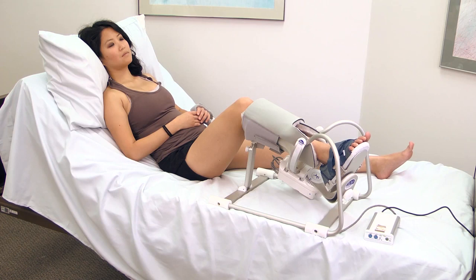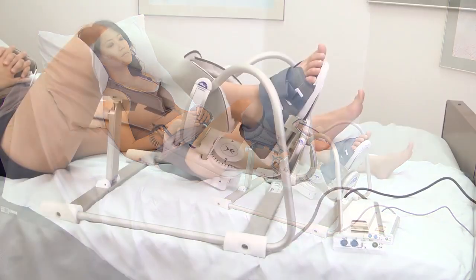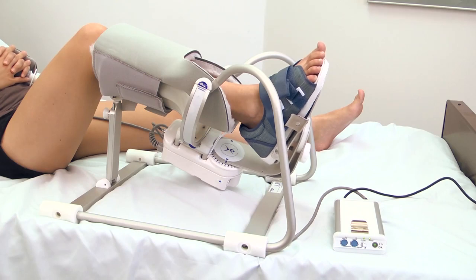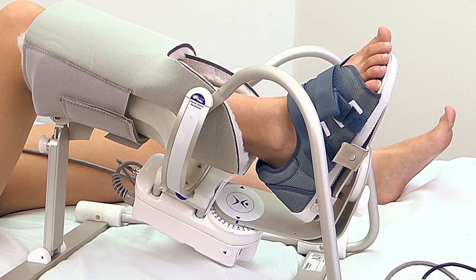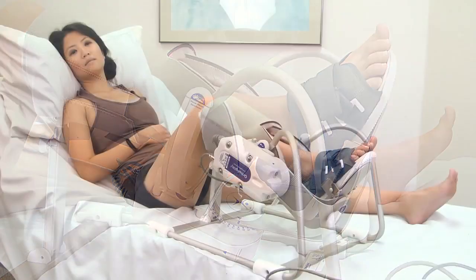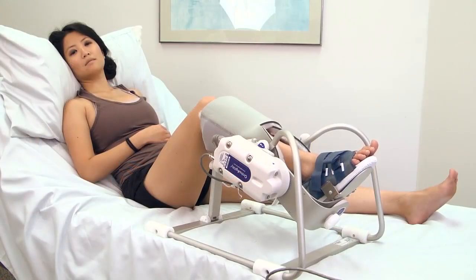For combined plantar dorsiflexion and inversion eversion, position the actuator and footplate at various positions to achieve the desired combination. Set range of motion limits as previously described and begin treatment.